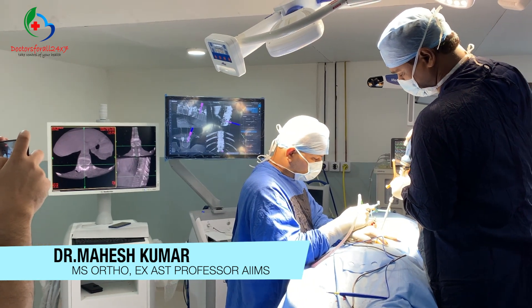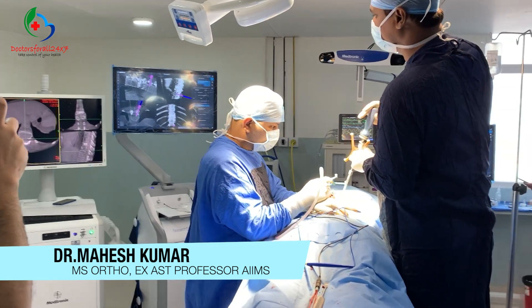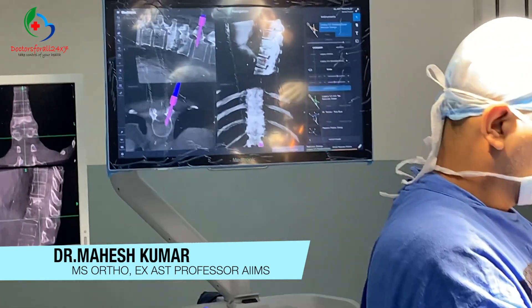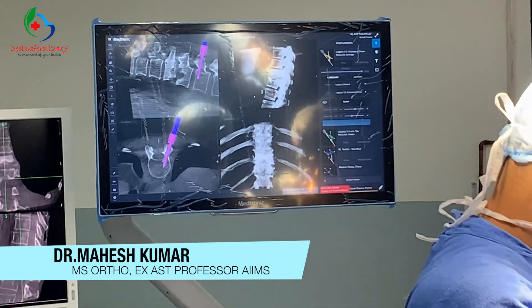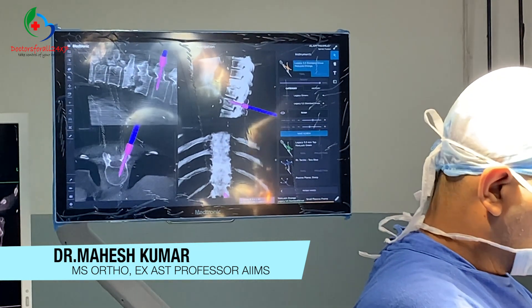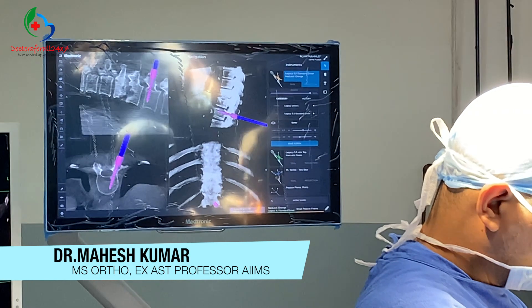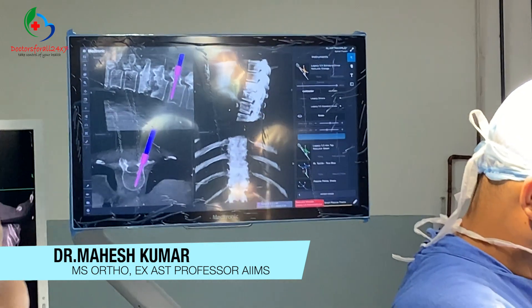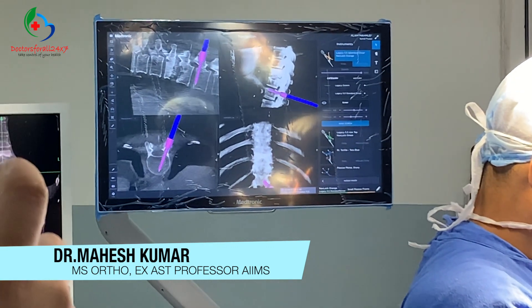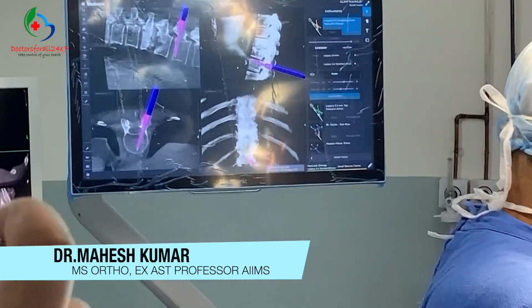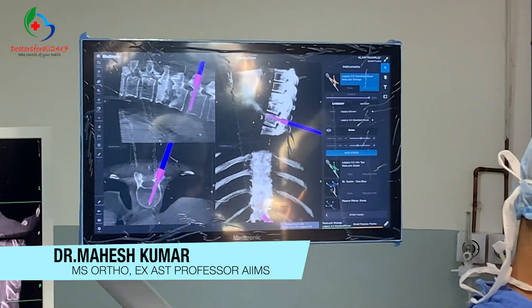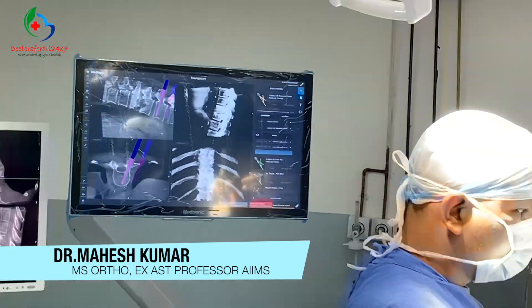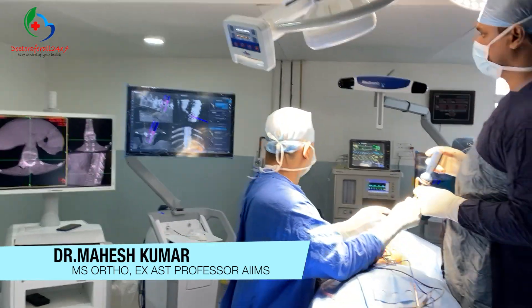And there we go — this is the scene under complete Stealth Navigation control. We are performing these steps to ensure that the patient's instrumentation strength is finally converted into the expected outcome intended to achieve. That is the beauty of O-Arm with Stealth Navigation.